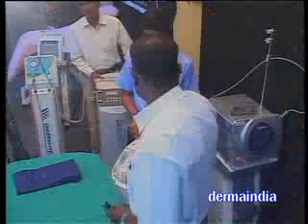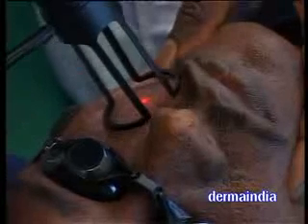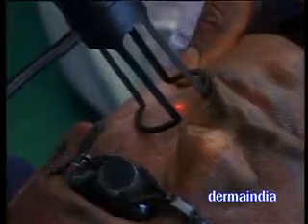This will heal in approximately 2 weeks. For the next patient, angiofibroma, I am using continuous mode. The laser light — the red light will guide you as to where the laser will be focused. Each lesion will hardly take one shot.